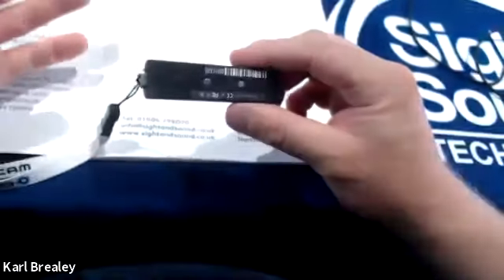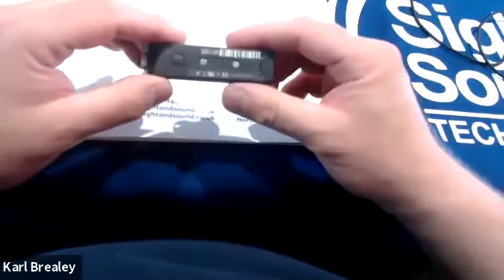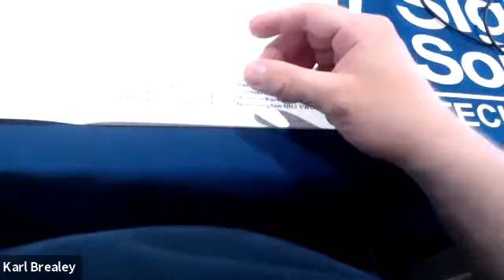Now, to start turning this on initially, you'll press it, long hold. You'll feel it vibrate as it kicks in. And as it starts to boot up, you'll hear it bleeping. It will just do a few bleeps, and then it turns on. And I'll tell you what, if I pause it.